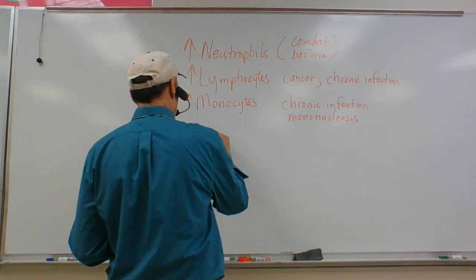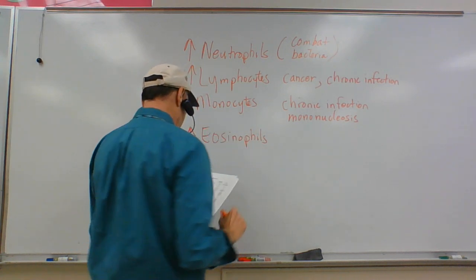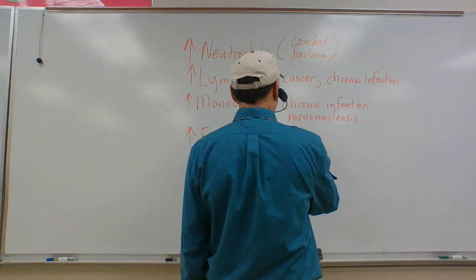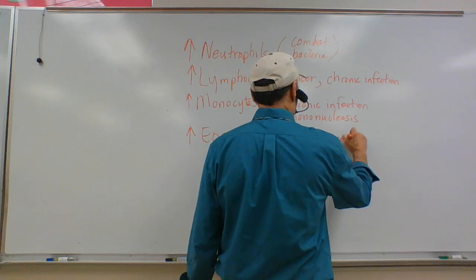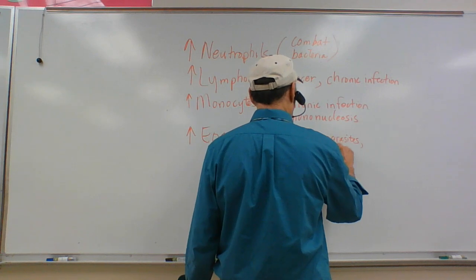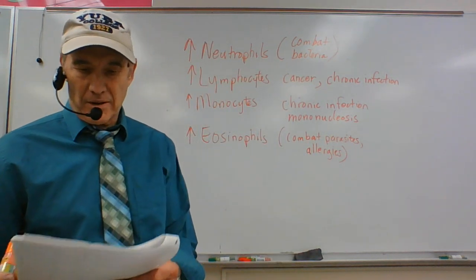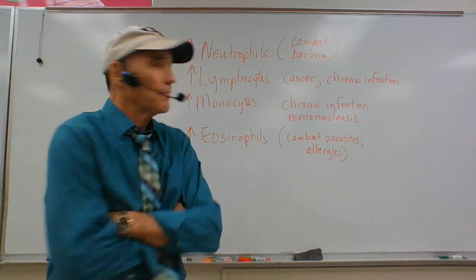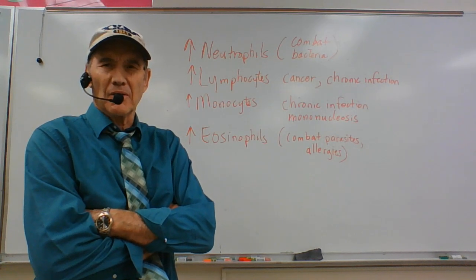Elevated eosinophils. Remember, they combat parasites and allergies. So you've got an individual with an elevated eosinophil count.